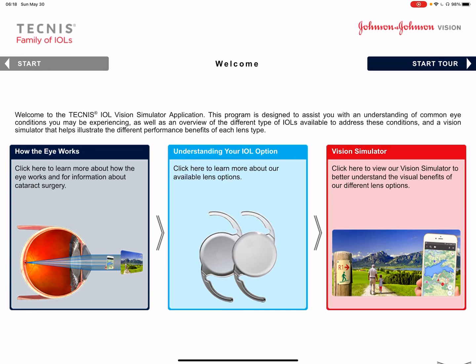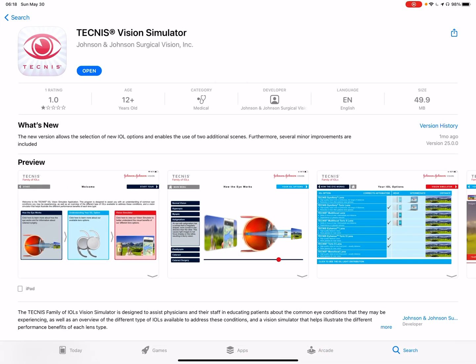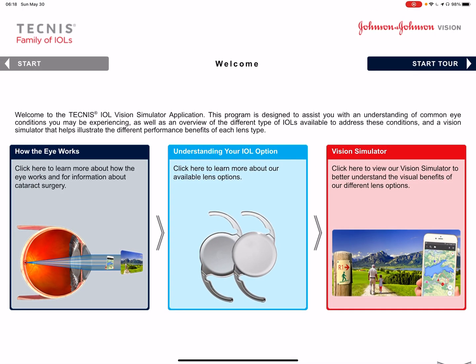Good morning. I'm Dr. Yusuf. I'll be walking you through one of the nice apps that Johnson & Johnson has made to simulate vision for patients that are going through cataract surgery to make lens choices. This is how the app looks like — you can download it from the app store. It's called the Tecnis Vision Simulator. The app goes through the normal eye, then the lens options, and the vision simulator for that.